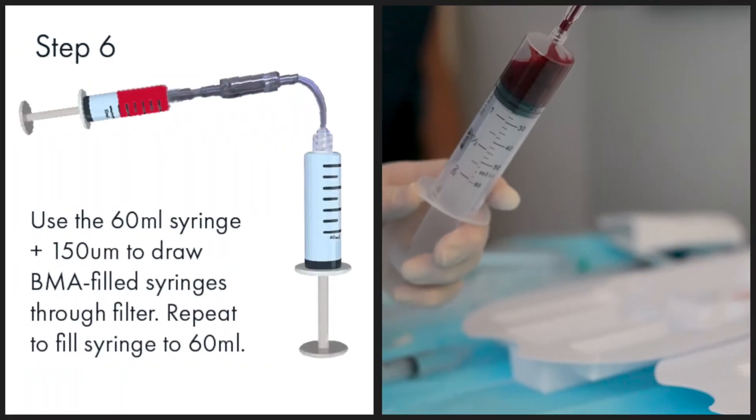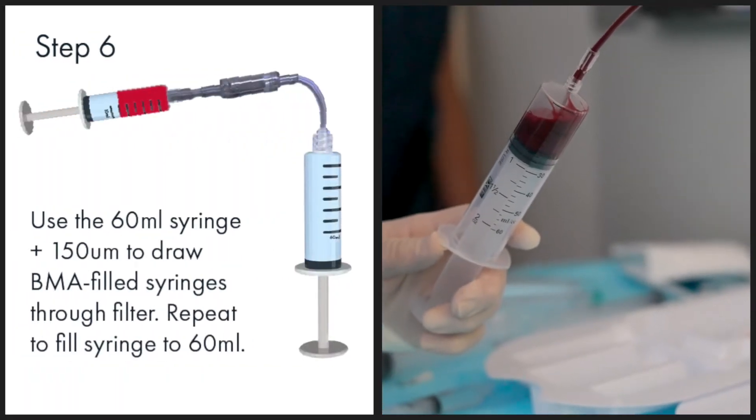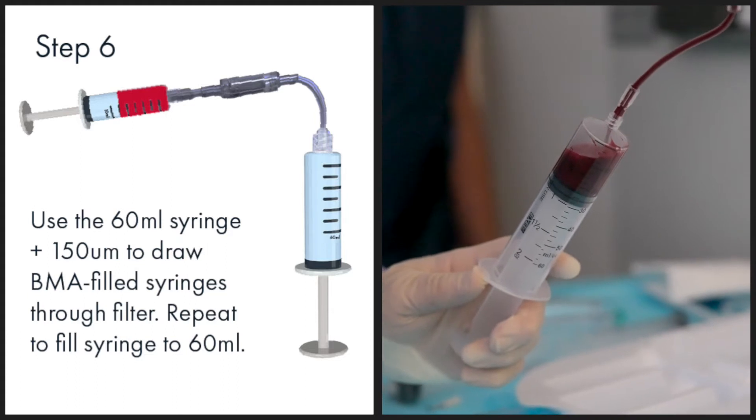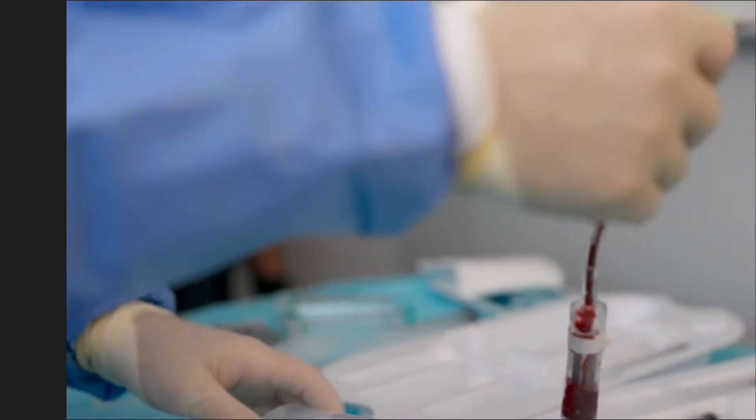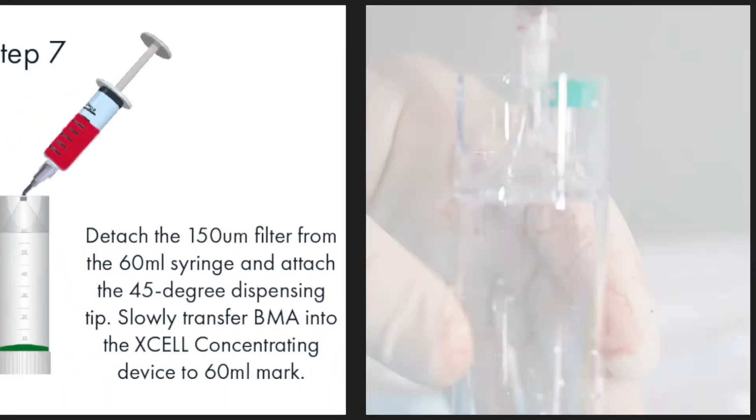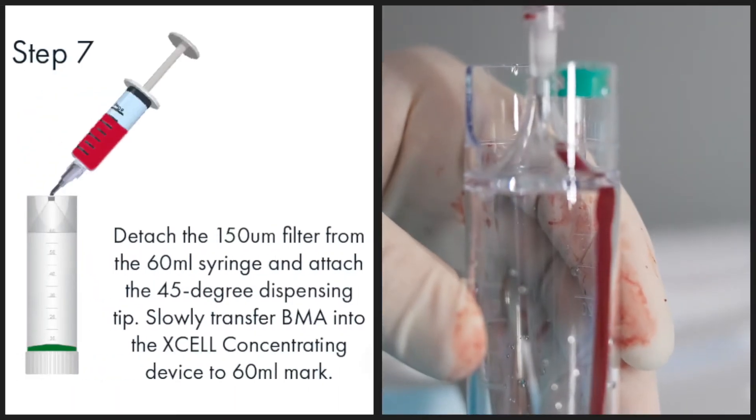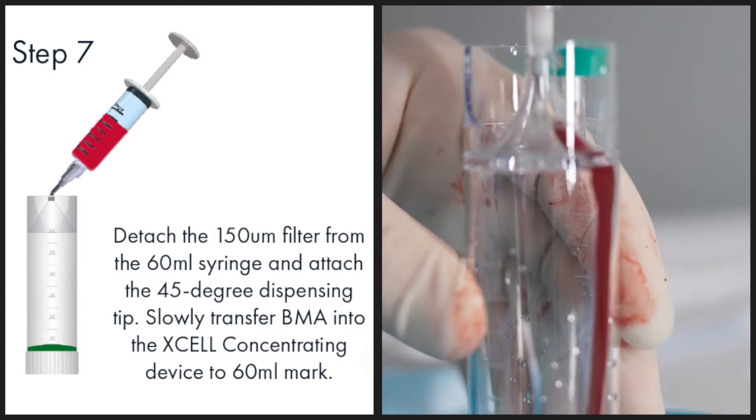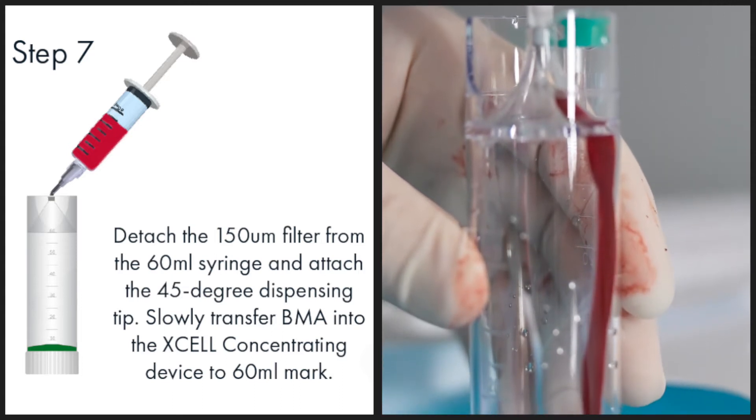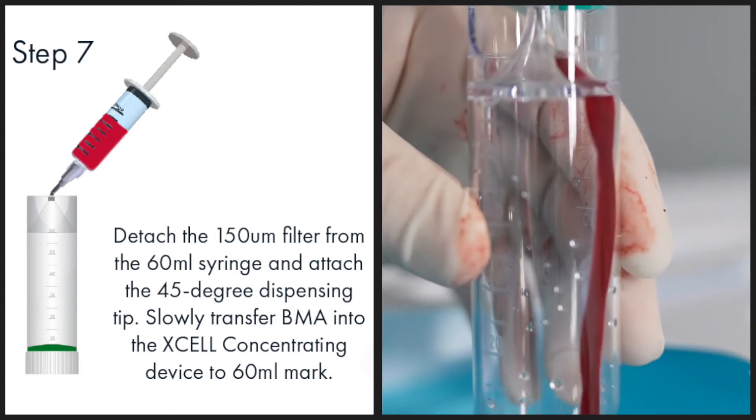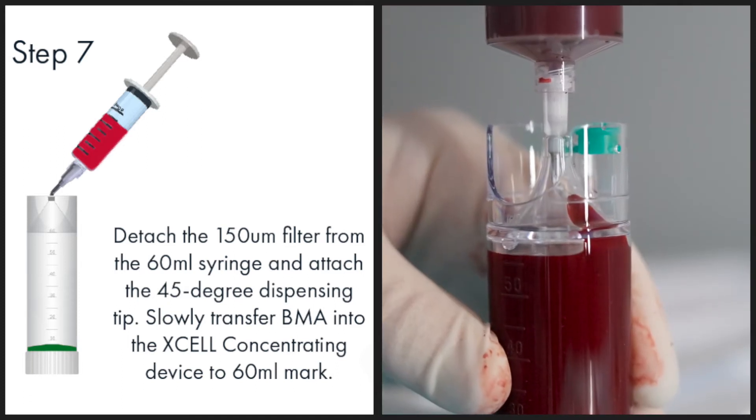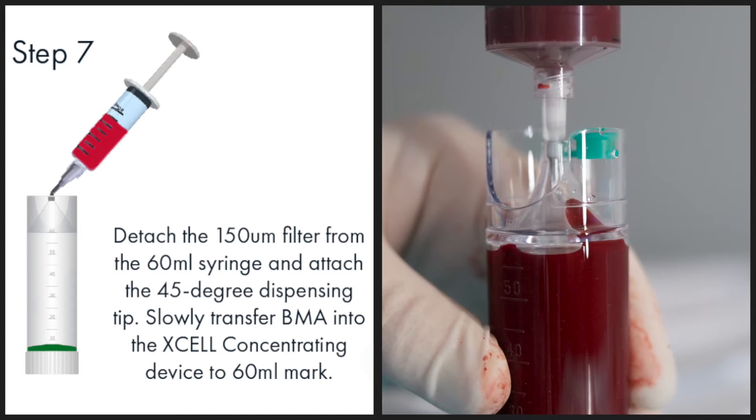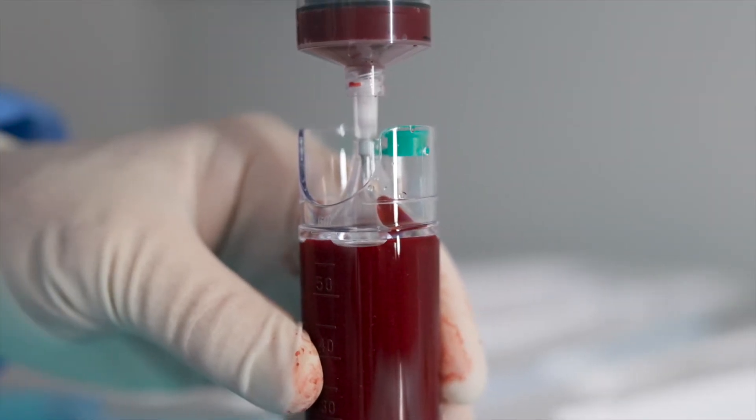Use the 60 milliliter syringe with the filter to draw all of the 10 milliliter bone marrow aspirate filled syringes through the filter to fill the 60 milliliter syringe. Detach the filter from the 60 milliliter syringe and attach the 45 degree dispensing tip. Slowly transfer the bone marrow aspirate into the XL concentrating device to the 60 milliliter mark.